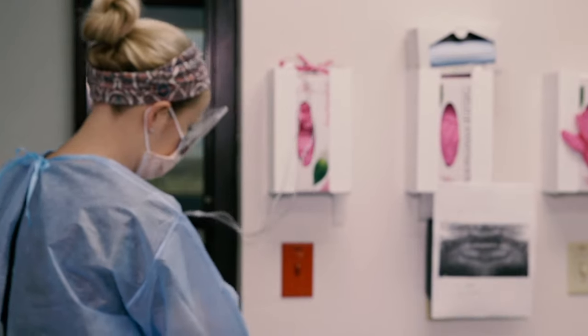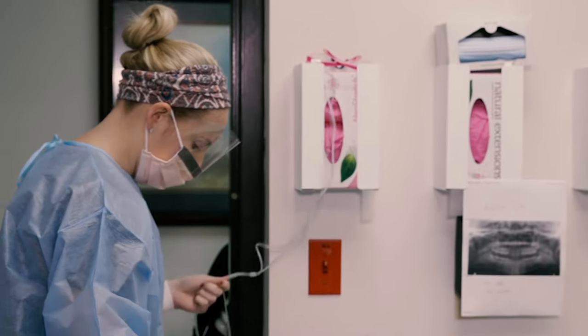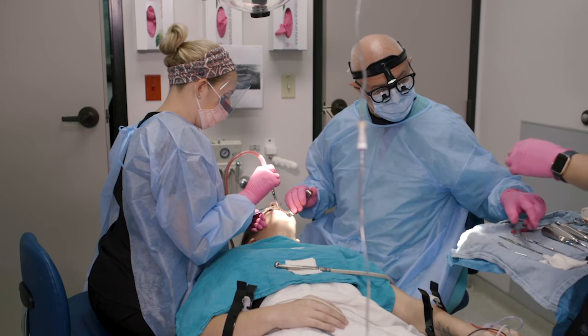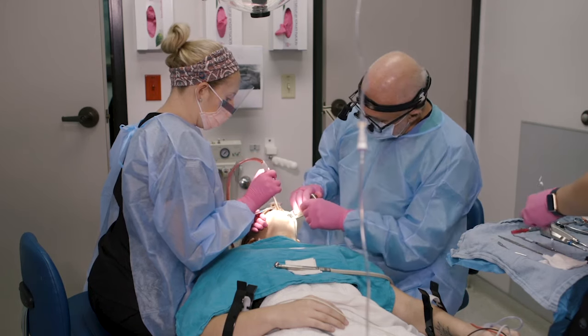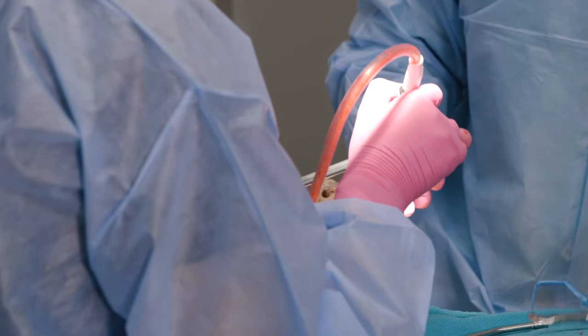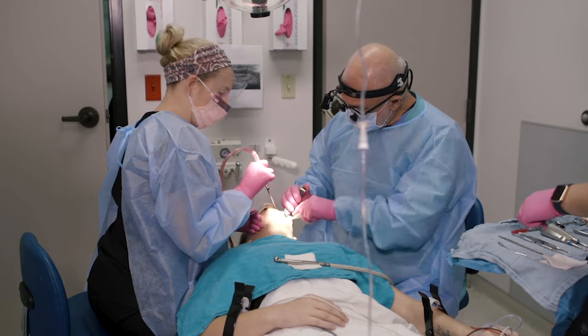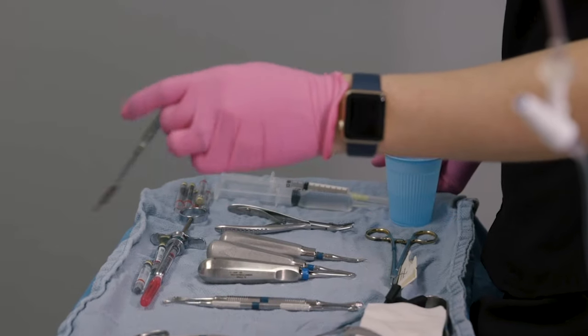Today it's going to be a 35 or 40 minute procedure because there's not enough room for the wisdom teeth to come in. The mouth is straight and the orthodontist wanted the wisdom teeth removed to prevent problems with the teeth shifting around.